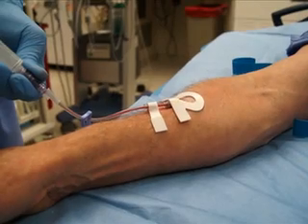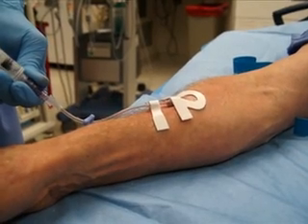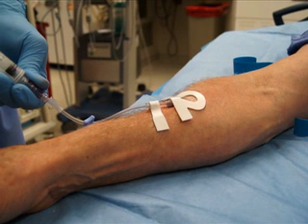Flush the catheter with sterile saline. The flush should flow smoothly into the catheter. If there is resistance, the catheter may be kinked, occluded, or outside the vein. Look for signs of extravasation, such as pain, swelling, or blanching.